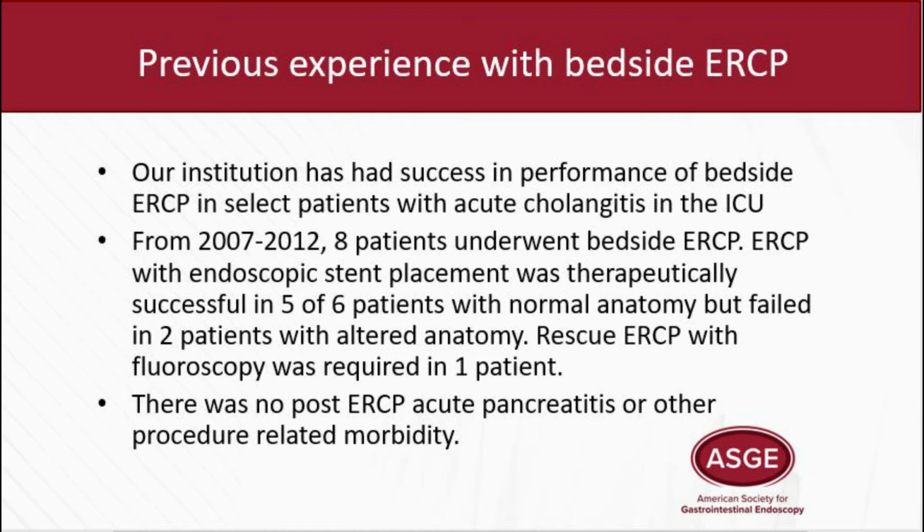Our institution has had success in performance of bedside ERCP in select patients with acute cholangitis in the ICU. From 2007 to 2012, 8 patients underwent bedside ERCP. ERCP with endoscopic stent placement was therapeutically successful in 5 out of 6 patients with normal anatomy, but failed in 2 patients with altered anatomy. Rescue ERCP with fluoroscopy was required in 1 patient. There was no post-ERCP acute pancreatitis or other procedure-related morbidity.